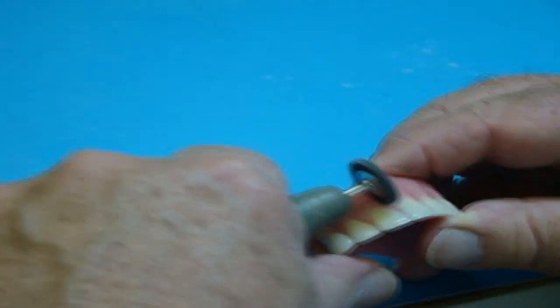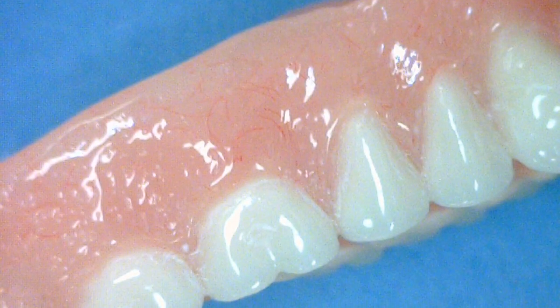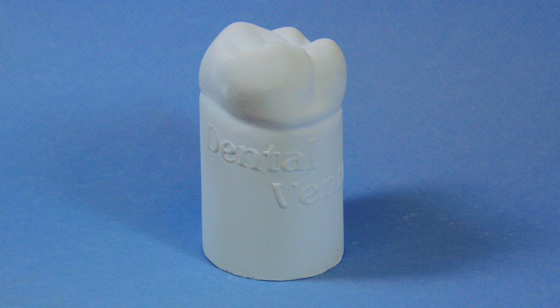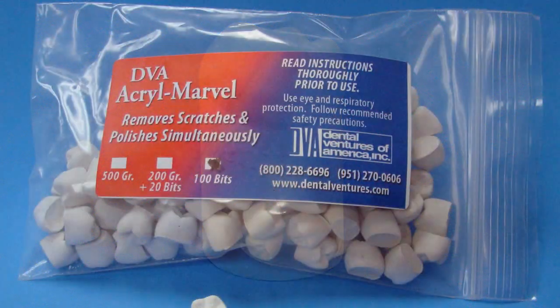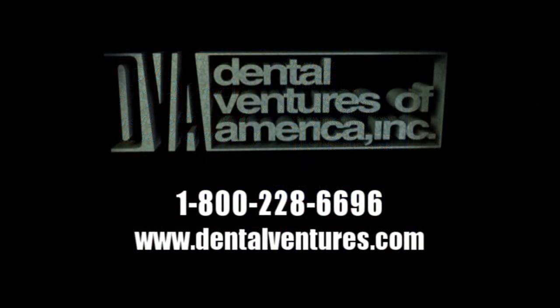And it's also great for orthodontic appliances. Clean, fast, and hygienic. Acromarvel is provided in either a 500 gram lab size or in a repair bit kit, which includes 100 individual tooth-shaped bits to be used for each individual repair case, which prevents cross-contamination. Call our toll-free number 1-800-228-6696 or visit our website dentalventures.com to order your Acromarvel today. We look forward to hearing from you.